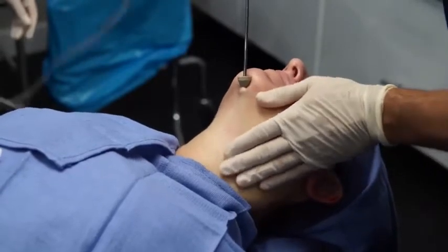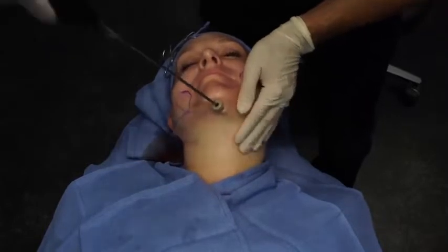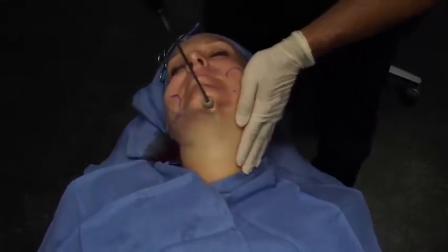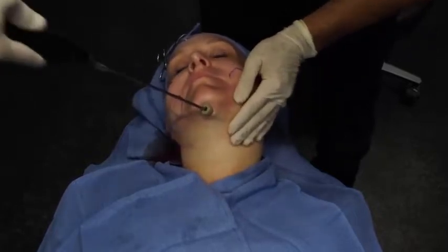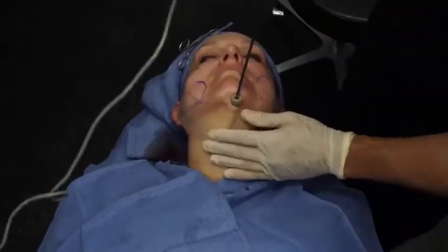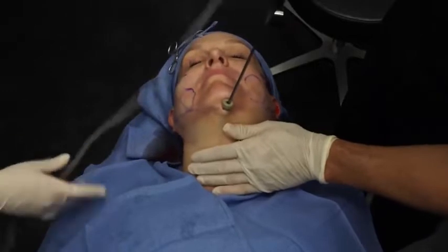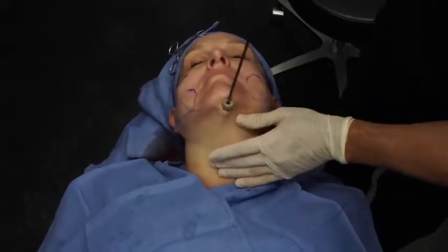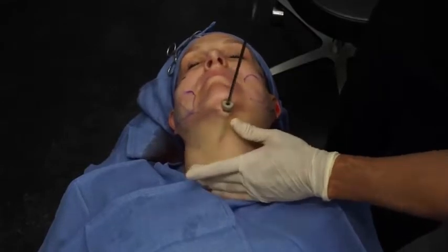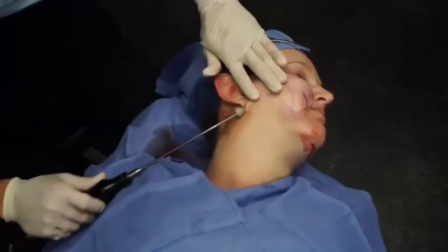So here we are using ultrasound energy to do a little bit of lipolysis, but more importantly to do our subdermal dissection as well. I'm using a 5-ring handpiece at 70%. Very important to keep in mind when you're using multiple energy modalities that you have to be a little bit more wary of the amount of energy you're using for each one of these, as a combination could create a significant thermal load.